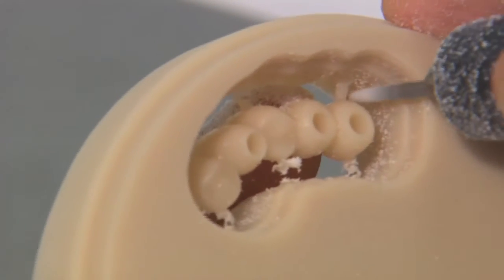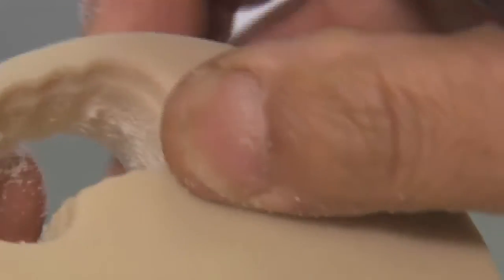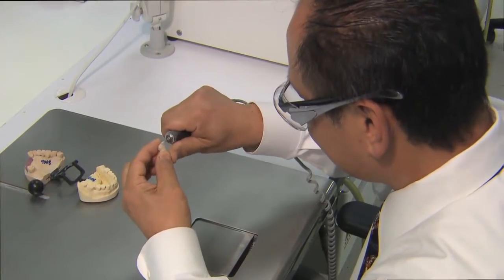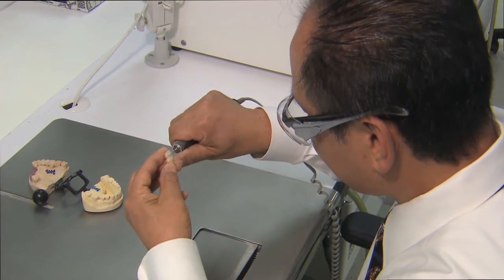The technician removes the prosthesis from the disc using a handpiece and begins to touch up the BioTemps bridge with a burr and disc to ensure lifelike aesthetics.